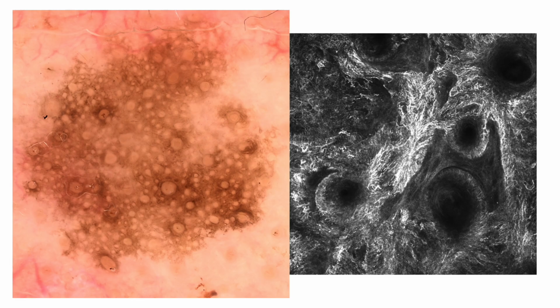One thing that is interesting in this case is to remind ourselves that when interpreting lesions located on the nose, we should always be aware that the dermoscopic parameter of the obliteration of the hair follicle can be barely visualized because of the anatomic area that we are exploring. But of course, you can see very well here the presence of this junctional nesting and these dendritic cells that are surrounding the hair follicle and then spreading towards the interfollicular area, moving to the other hair follicles.